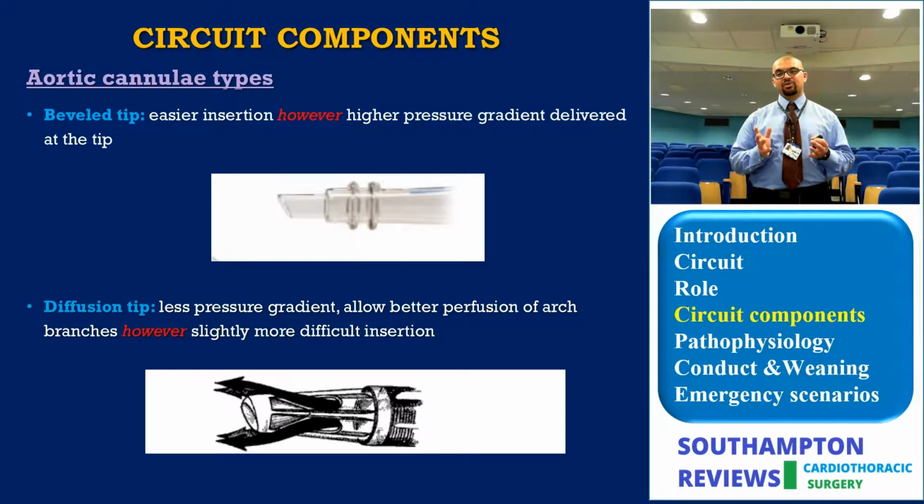Yet the diffusion tip, on the other hand, creates less flow acceleration, as you can see here, less peak gradient, and is less likely to dislodge atheroma and plaques. Yet in the view of some surgeons it's more demanding in insertion. Of course, it's completely relative. If you are doing it every day, it will be easy in your hand. If that's the cannula you use every day, it's easy in your hand. This is just relative.